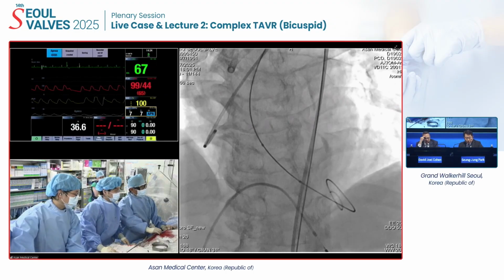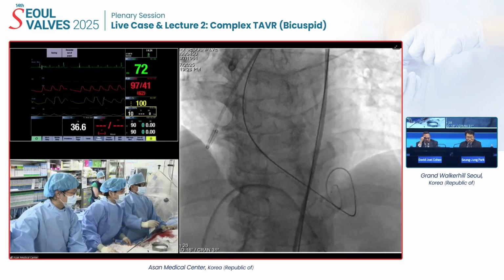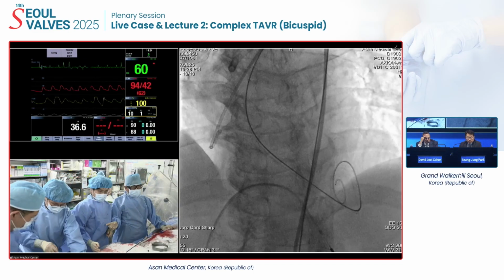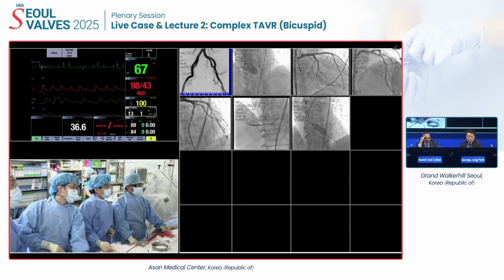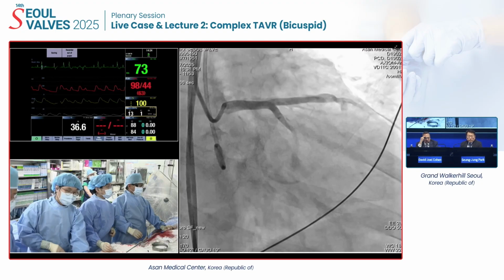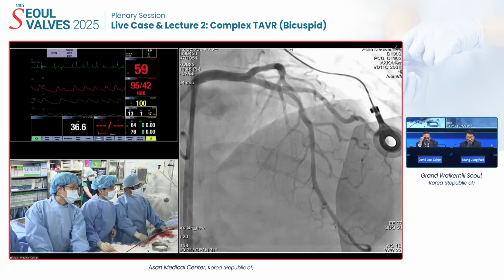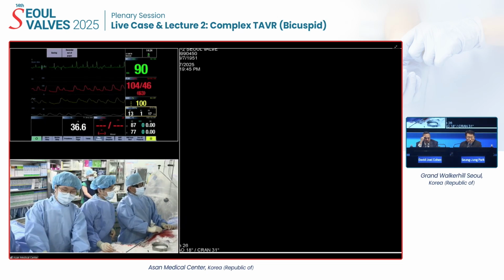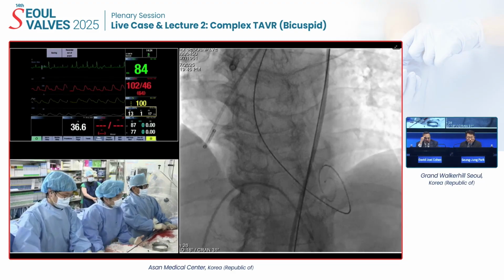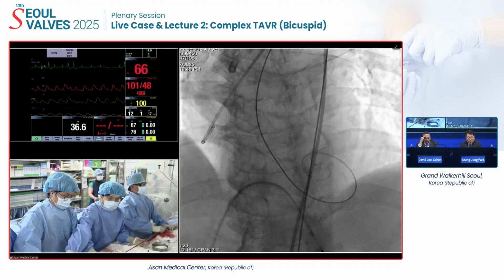Does this patient have meaningful coronary disease or not really? We checked the coronary angio based on the CT coronary angiogram for pre-operative planning. Not too bad, a very intermediate disease. She has coronary disease, but nothing severe.